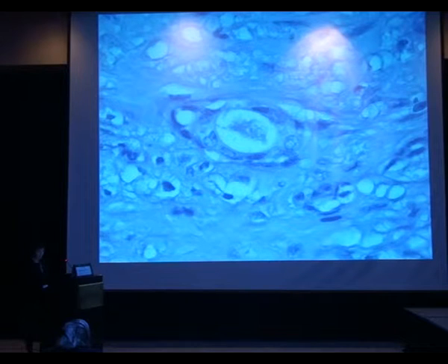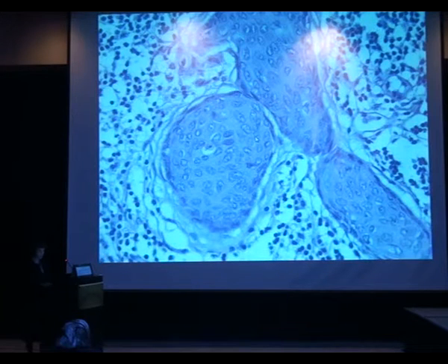Some aspects here like that with fusocellular cells. This could be something like, it could be maybe keratin bundles here, we are not completely sure. And here you have clearly epidermoid differentiation.